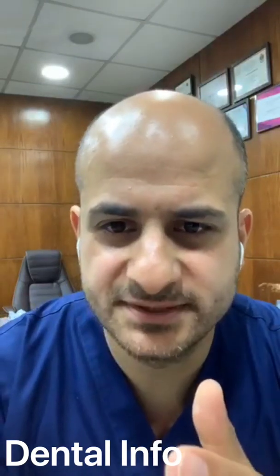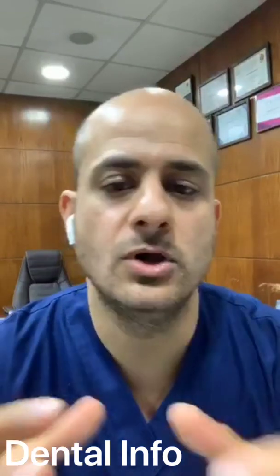Yes, Dr. Jasprit here says, wow, the way gutta-percha comes out and seals the apical third with Fast Pack was a treat to the eye. Yes, you are always happy with this result. I recommend you always, if you want to shift to the warm vertical compaction technique, to start training extraorally. Do not go and start doing patients' RCTs with warm vertical compaction with no information or without experience. You have to take courses or see demos, make extraoral demonstrations, and then you can shift and go to treat people or fill canals with warm vertical compaction.